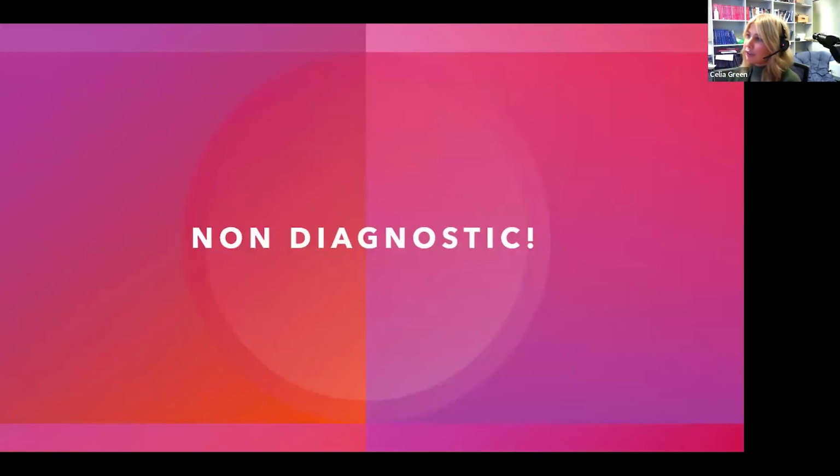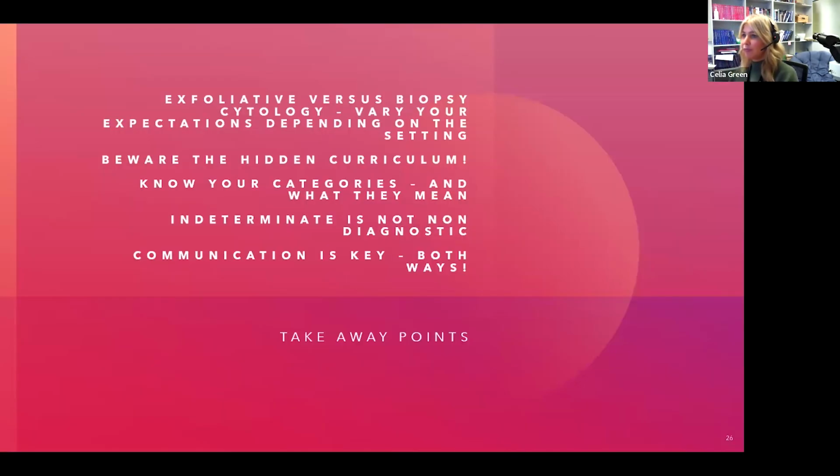It's non-diagnostic. So the thing I really wanted to hammer home is that across specimens, across pleural cytology, it doesn't matter what you're seeing. If it doesn't fit, it's not diagnostic. That's not sarcoidosis just because you see non-necrotizing granulomas, just the same as if you see atypical mesothelial cells in the pleural fluid, it's not necessarily mesothelioma.